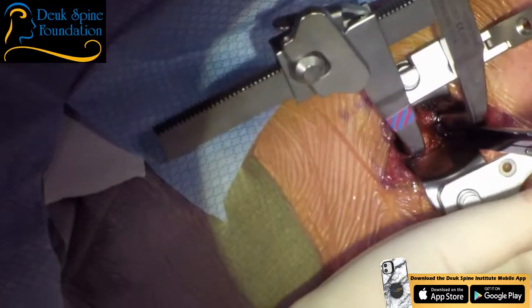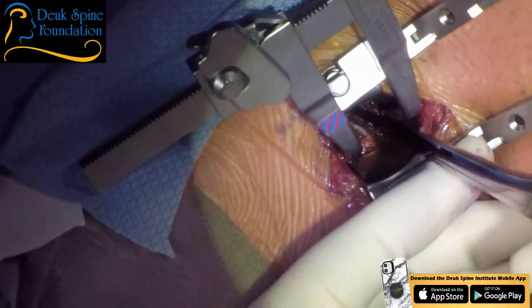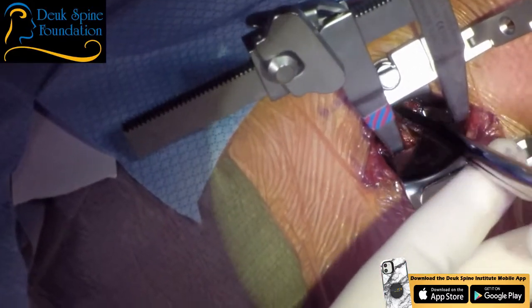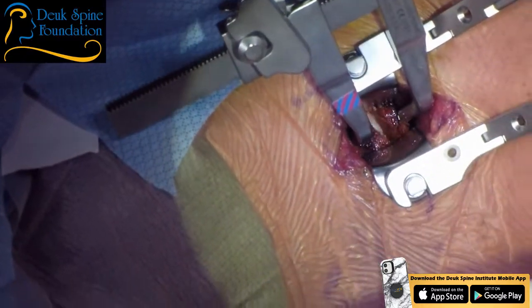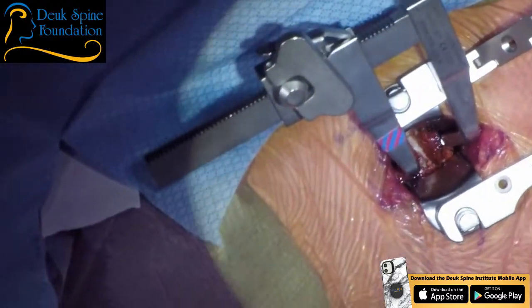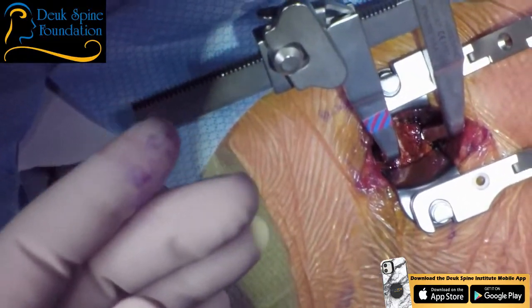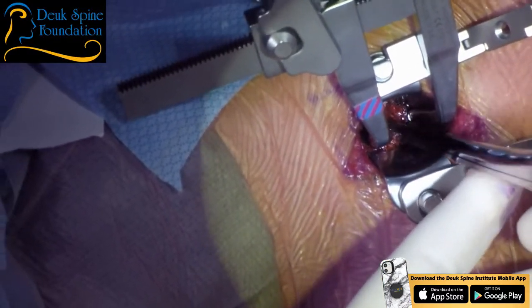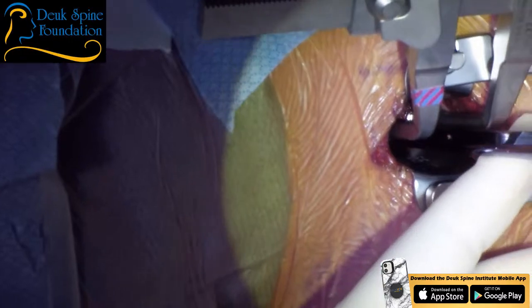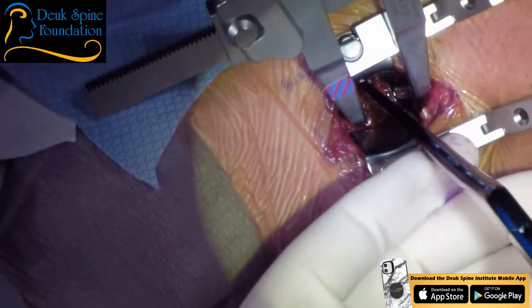Hey, why am I saying this, folks? Because if you are watching these surgeries, which we hope you are, and you want to improve your technique if you're a surgeon, equipment is so important. You need the best equipment for the job. If I didn't have the proper retractors or the proper curettes, then these things would be moving around during the surgery, making my job 1,000 times harder. And once they start moving around on you, then you're going to injure something you shouldn't be injuring, because they're retracting important vital structures like the esophagus and carotid. And if they're moving, then you're going to grab something that just got moved that you shouldn't have grabbed. Okay, I'm telling you, I've seen it happen, not with me, but with other surgeons.